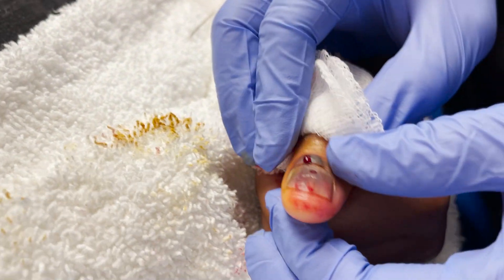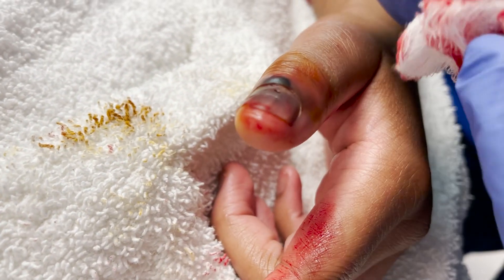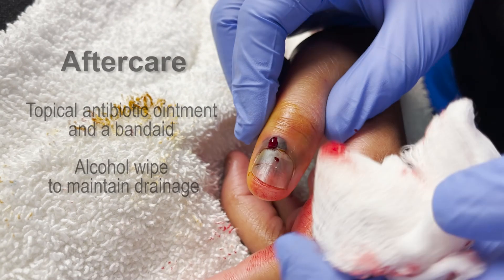You can actually start to see the nail color a little bit more — it still looks bruised. What I would do then is put some antibiotic ointment on that, and then just do a loose dressing and go home.